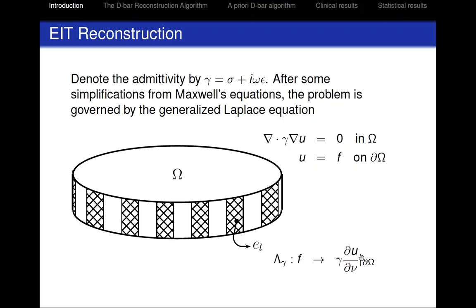It's interesting, in the EIT literature, all of the theory is posed in terms of the Dirichlet to Neumann map, whereas in practice we use the Neumann to Dirichlet map because the process of applying currents and measuring voltage is a damping operator, so noise is minimized, whereas if we were to apply voltage and measure current, noise would be amplified. In theory, there's no noise, and you don't have to worry about it, and that's why I guess traditionally it's the Dirichlet to Neumann map.